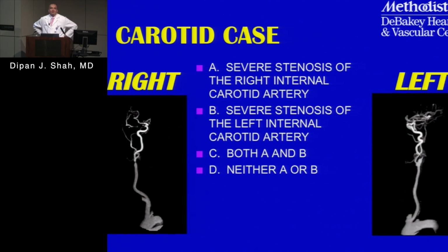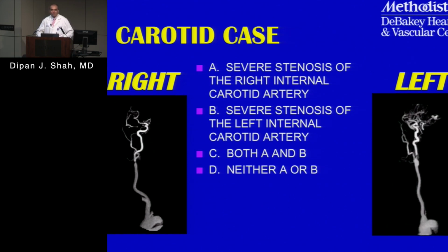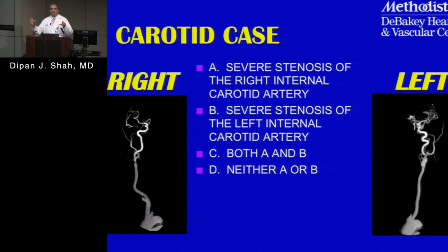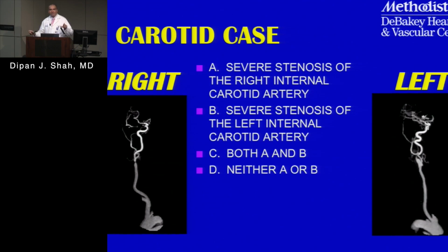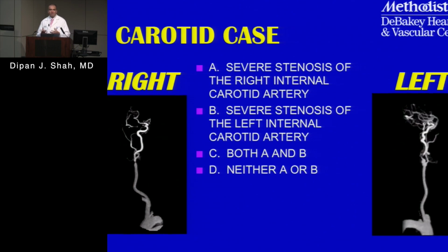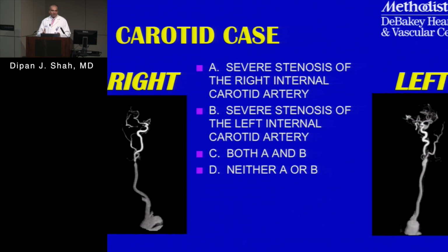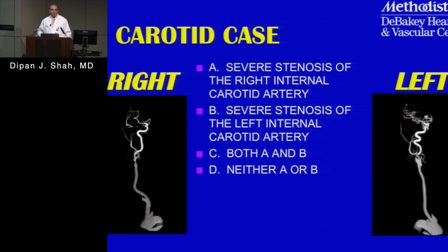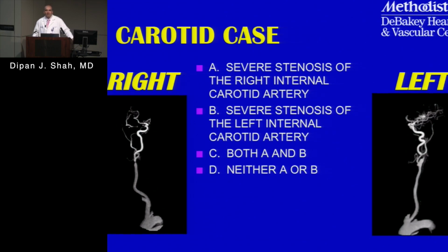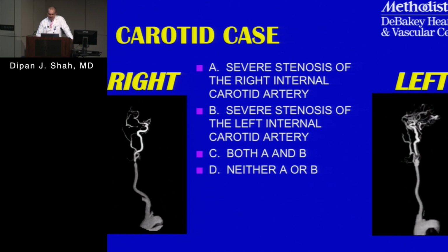So two things actually. In peripheral vascular disease, even in the lower extremities, you'll notice frequently lesions tend to be bilateral. So oftentimes you'll see a lesion on one side, you'll see it on the other side in the PAD. So maybe it has to do with just the shape of the vessel and the geometry that somehow leads to that. We know for the carotid that the most common location is the proximal internal carotid. So that fact, I think it's hard to make anything of.